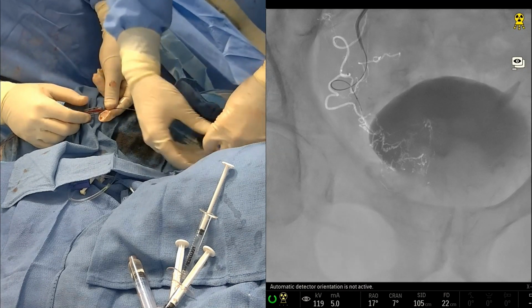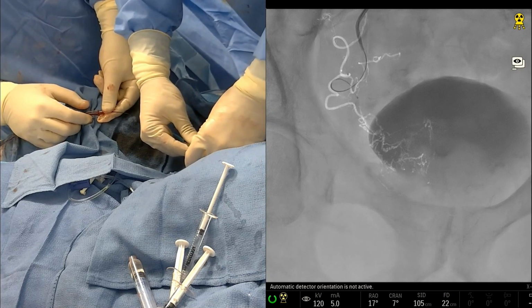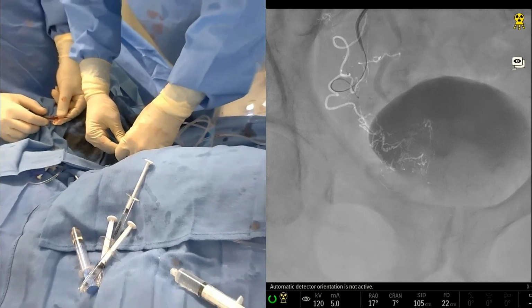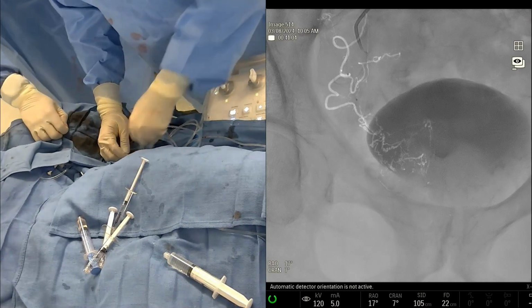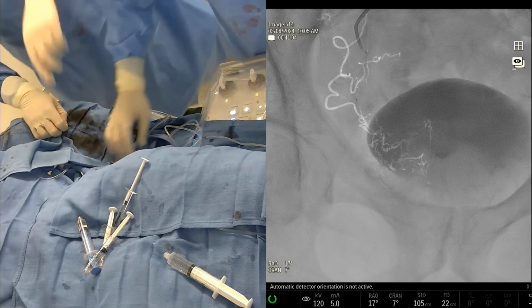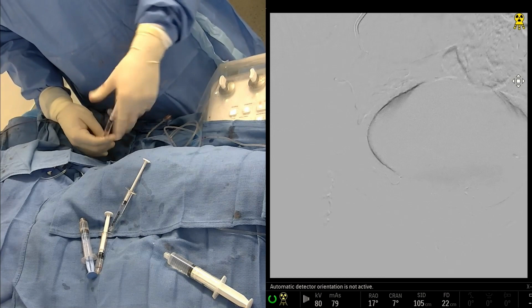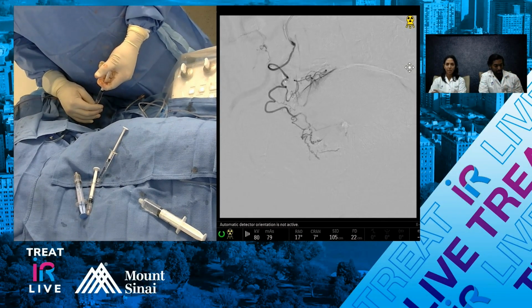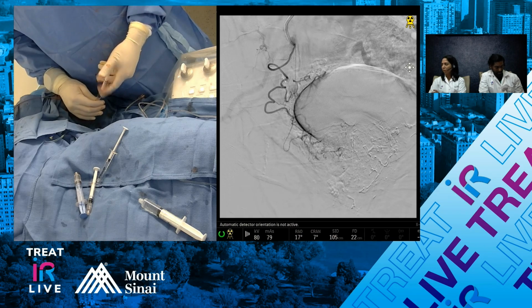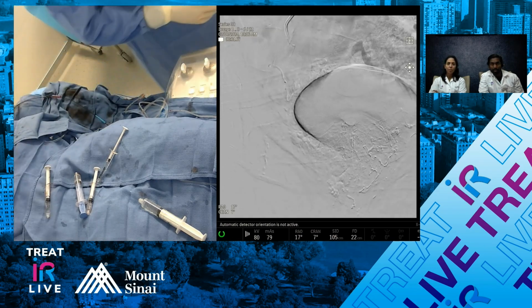You know what? Grab Debbie. Grab the Asahi wire. If we can show that one, that I like for these turns. We don't need a better curve on this. You can also just do a better roadmap because that roadmap doesn't look very accurate anymore. I think it's important that we kind of show the glue and the difference between the two sides. Yeah, we're going to show it. And time allowing, let's put that up as a roadmap, Debbie.